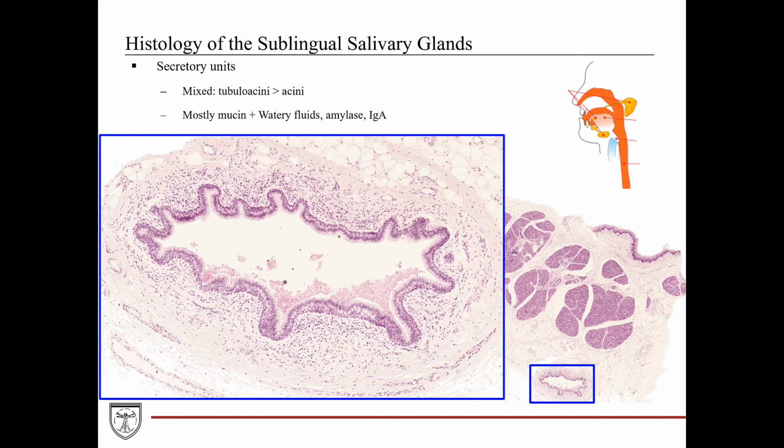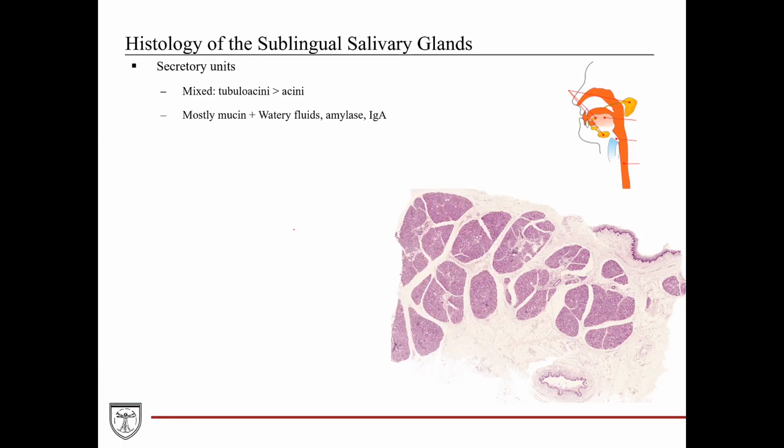So look at the lumen and the lining epithelium. The lining epithelium is a beautiful example of stratified columnar epithelium, which is reinforced by the lamina propria, the connective tissue, and also some strips of smooth muscle. And another interesting anatomical feature is this boxed area.